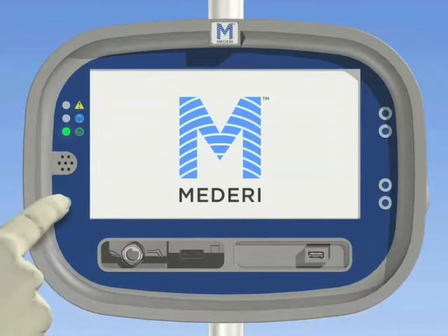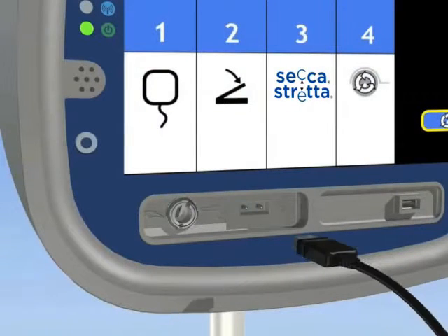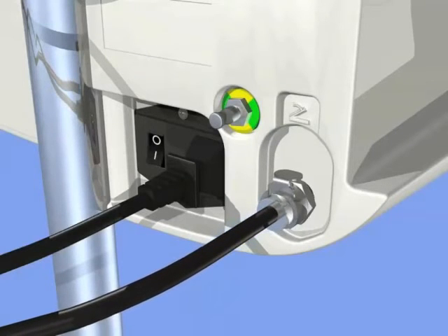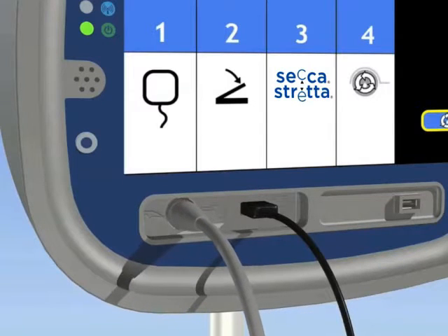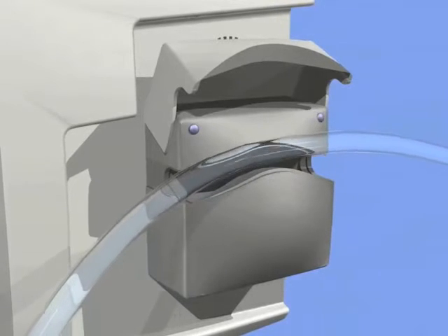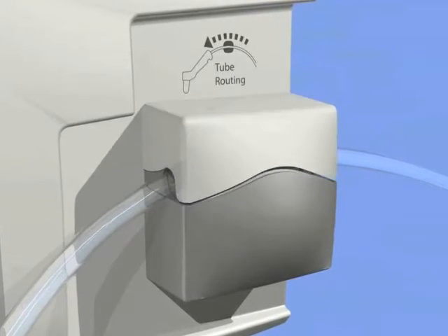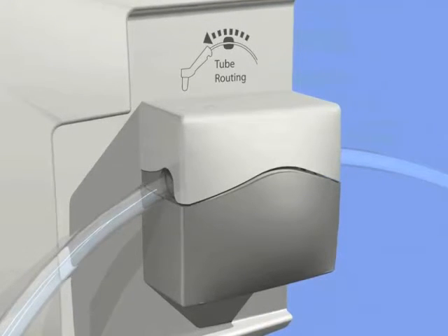Follow the on-screen instructions for connections to the generator. 1. Connect the compatible dispersive electrode pad. 2. Plug in the foot pedal to the back of the generator. 3. Attach the connecting cable to the strata catheter and connect to the generator. 4. Place the irrigation tubing through the slot in the pump on the right side of the generator. 5. Lay the silastic portion in the groove inside the pump with caution to avoid stretching or tension to the tubing.